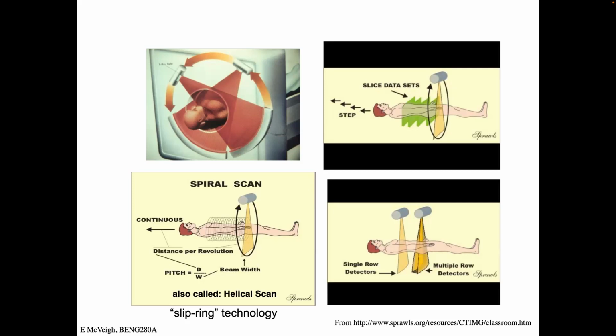to get Z information. And the way you zip the patient through is, while this thing is rotating, you use that really highly accurate table just to push the patient through at a certain speed, and you get a set of spiral projections, right? It's like a helical pattern of projections through the patient. And if I have a helix and I have one point at the apex here, then it goes around and I have my next point here, right? I can interpolate between those 2 points to get anything in the middle. So that's what they do. So if they need a whole set of points in a plane that falls between those two, I'm going to use the interpolated value of those 2 points, right? To get a full volume of data.